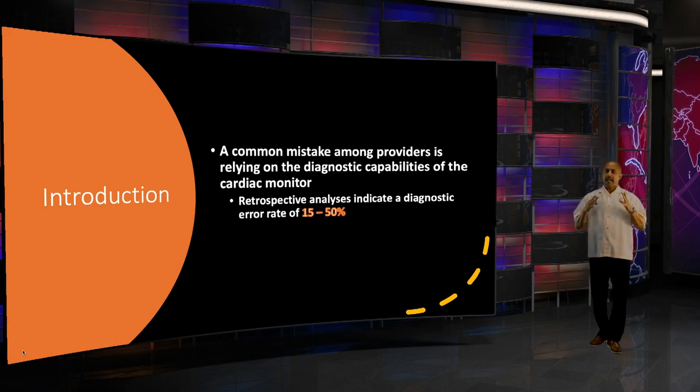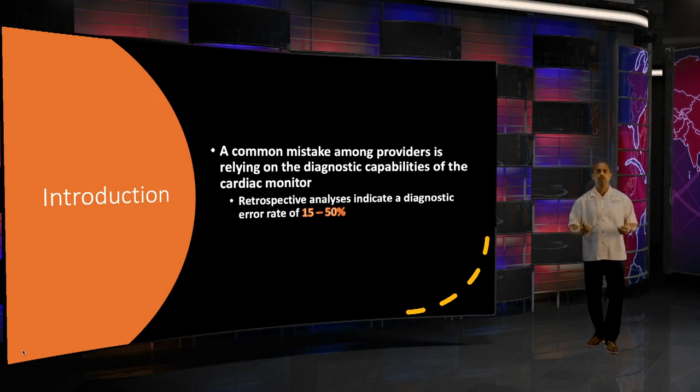I want you to know a lot of us rely a lot on diagnostic technology. The machine itself, that technology that we have with us when we do a 12-lead as a paramedic, we rely a lot of times on that machine printing out and telling us what we have here is a STEMI. And then we put all our eggs in that basket of the computer diagnosing the 12-lead. So I want you to know it is common for some of these machines to have some error. And the error factor could be anywhere from 15 to 50% error. So the machine is not always right, is the bottom line.